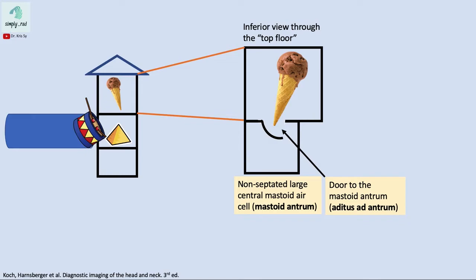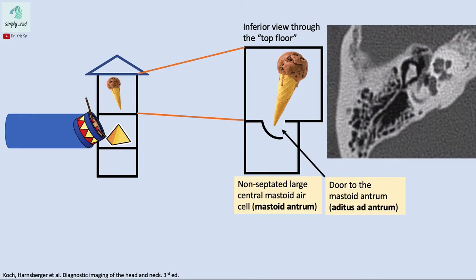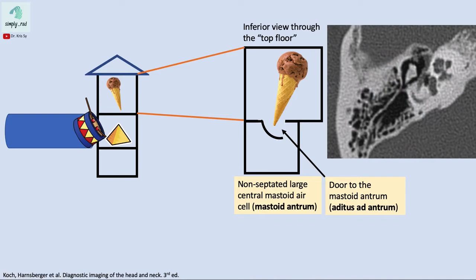Looking at an actual image through the top floor of our building: can you locate the ice cream and the cone? Here is the ice cream, here is the cone. The apex of the cone points to the door — the aditus ad antrum — which opens up to the mastoid antrum.